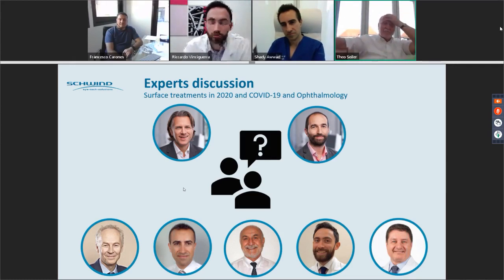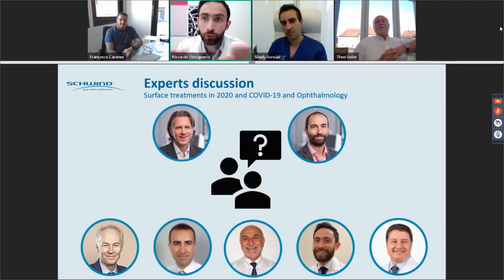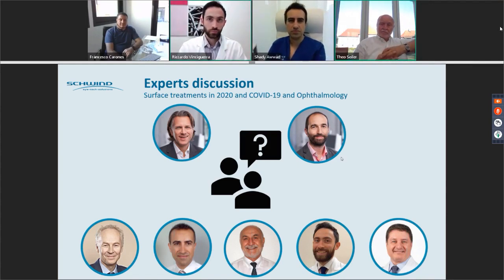So basically, we lift the eyelid, we drop the fluid from the bottom, so then it goes down. We ask the patient to blink twice, and then we keep the eye open like this, and in about 3 to 4 seconds the patient goes. And then we take at least 3 pictures. If we see that there is a difference between the 3 pictures, then we take it another time. Okay, good. More questions from you, guys?